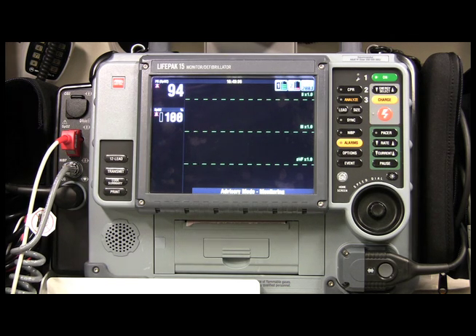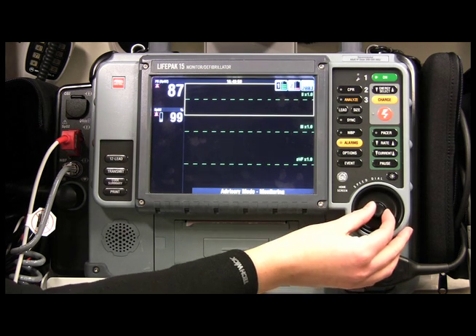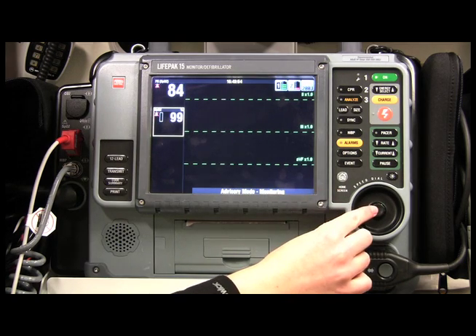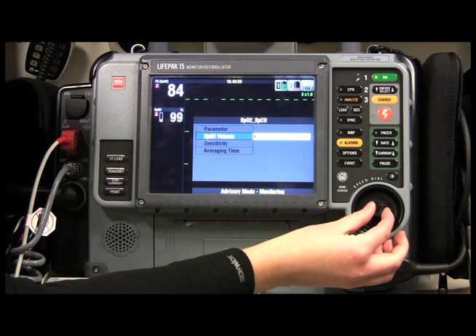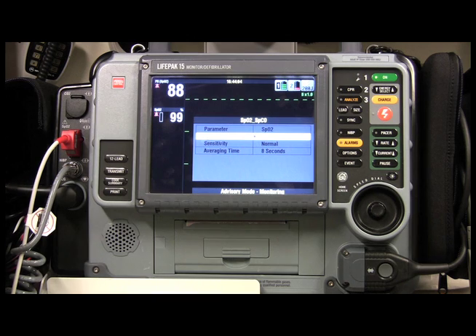Now you can listen to this wonderfully obnoxious tone during your ride. If you don't want to listen to it anymore because your patient is pretty stable, just come back to the dial, highlight SpO2, click on SpO2 Volume, and turn it off.